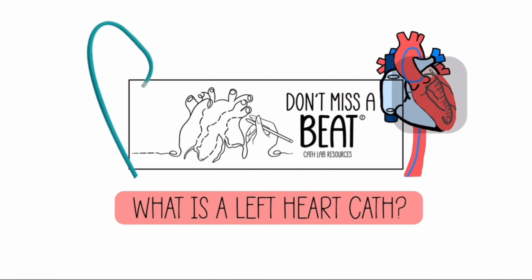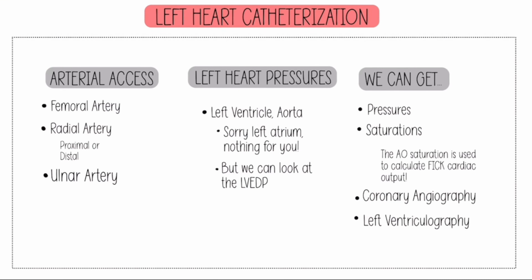So what is a left heart cath? A left heart catheterization. Remember, a patient might have a right and a left heart cath, just a left heart cath, or just a right heart cath. Just a left heart cath is definitely the most common that you're probably going to see a patient go for, and let's talk about the reason why.